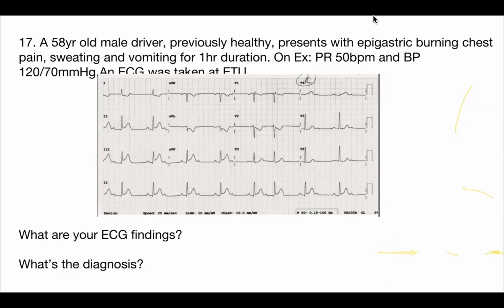And remember, the salient point in complete heart block is AV dissociation, and you will see more P waves than QRS complexes, right? And Mobitz type 1 is where you are missing just one beat after prolonging PR interval in subsequent beats, right? So that is just heart blocks. You have to know first degree, second degree, third degree, and then what is LBBB, what is RBBB, and then what is bifascicular and what is trifascicular. Just have an understanding, right?